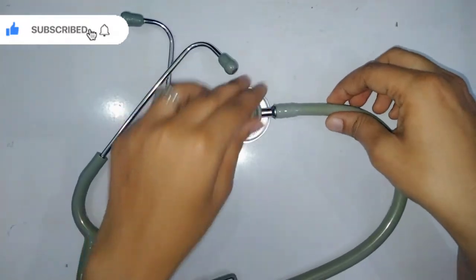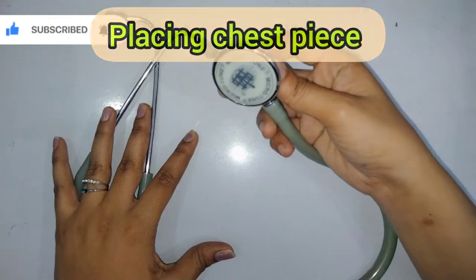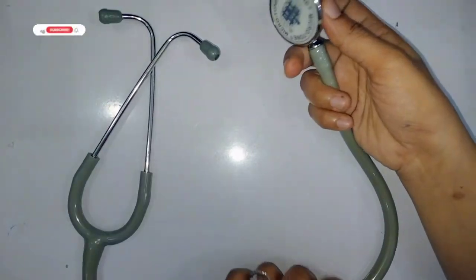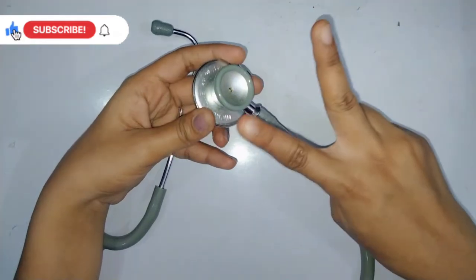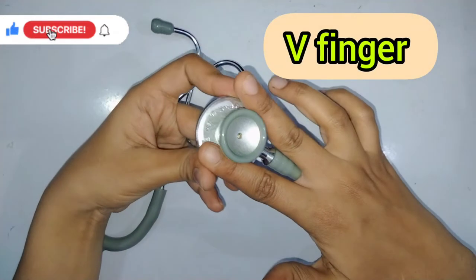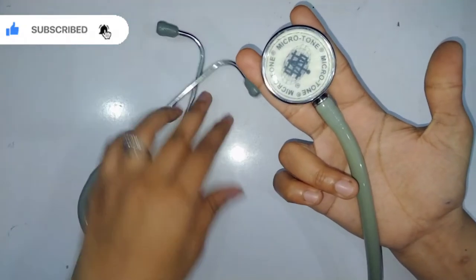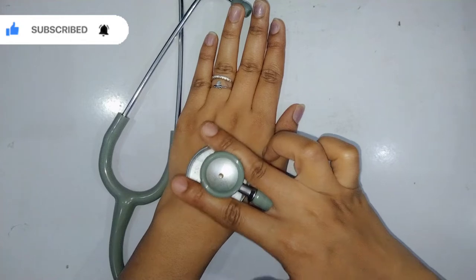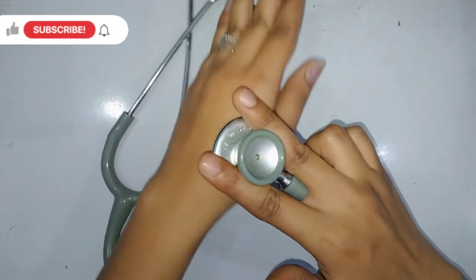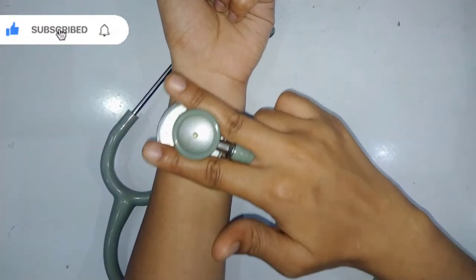Now, how do we place the chest piece on the patient's body? Take a V-finger shape, put it over the bell, make a sign like this, and place it on the chest of the patient's body. This grip is the main holding technique for the chest piece.